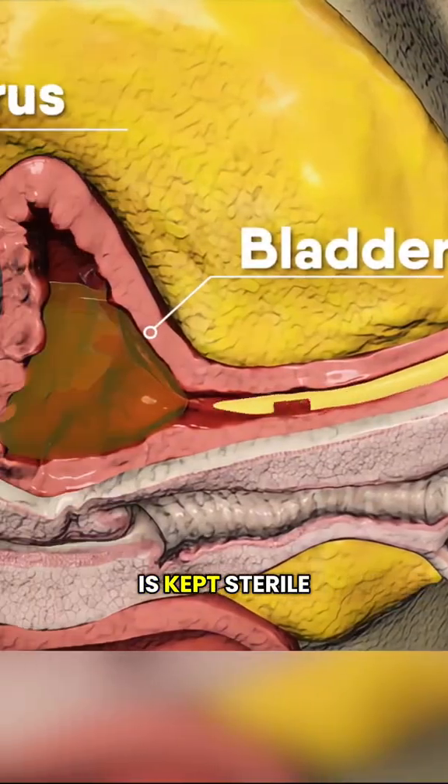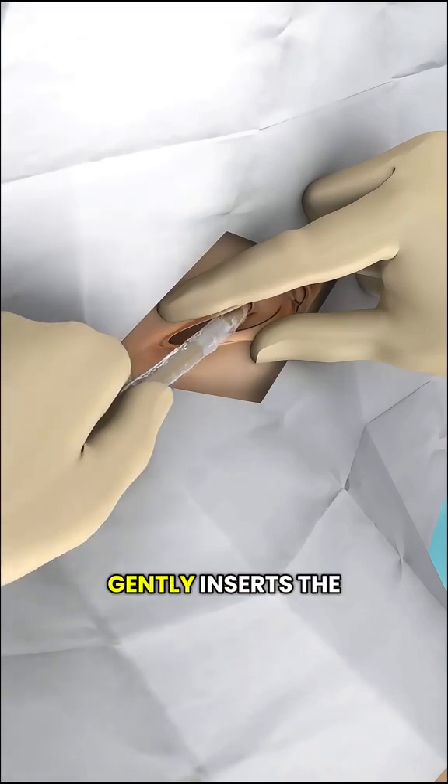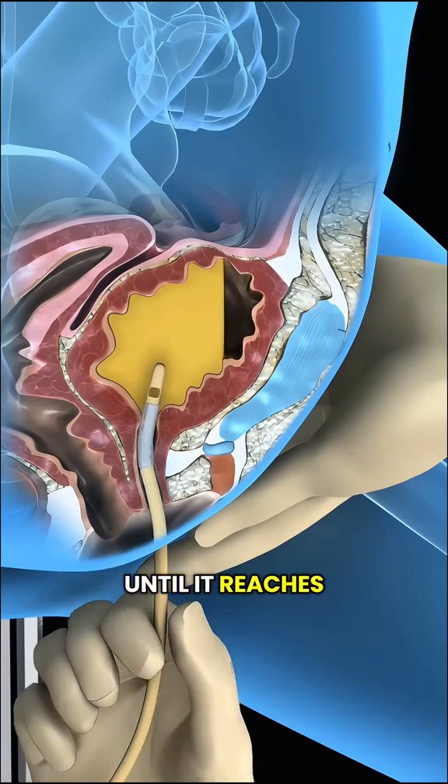First, the catheter is kept sterile and coated with lubricant to make insertion smoother. The healthcare provider gently inserts the catheter into the urethra — the tube that carries urine out of the body — and carefully advances it until it reaches the bladder.